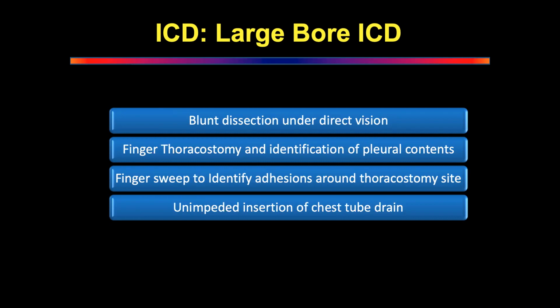What else? More hitting the important lung. We are in the lung, the lung is expanded. You are hitting an organ, wrong plane. There is an organ in front of you which is stopping you from going in.